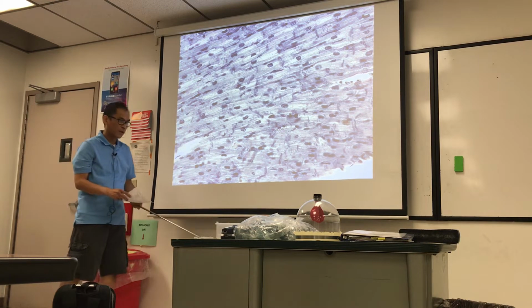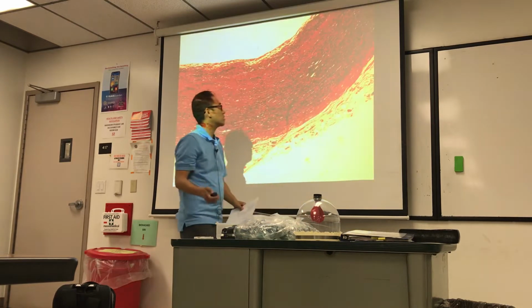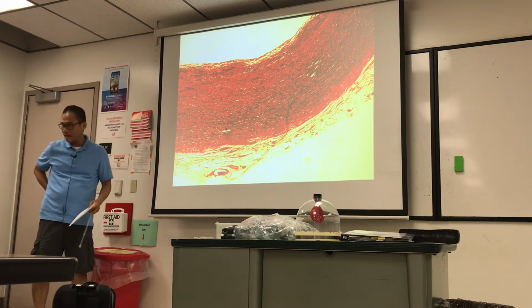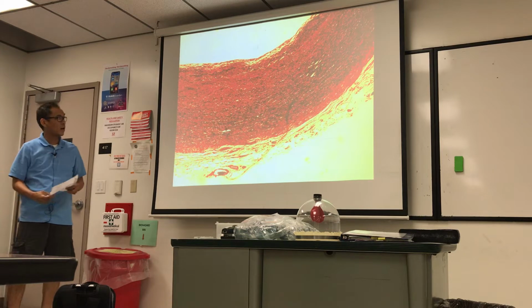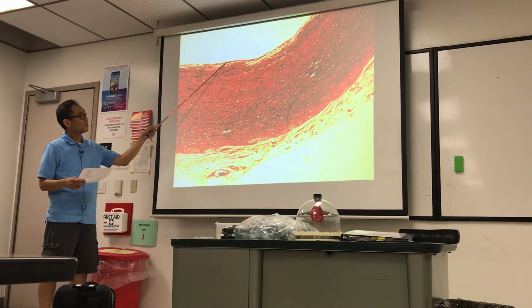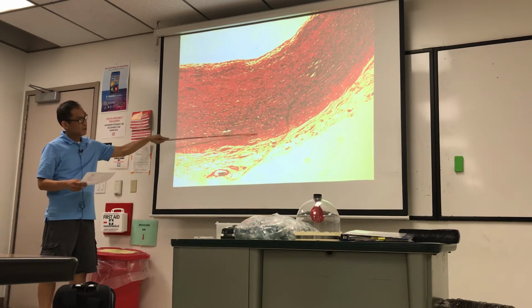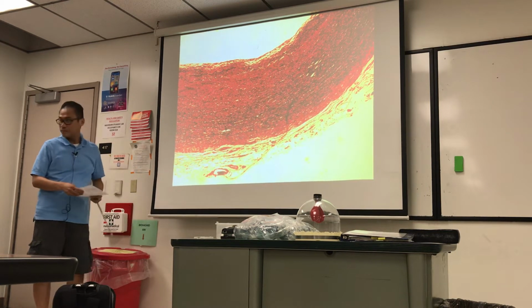So I started with the heart, then I have the arteries that it pumps blood into. The largest arteries close to the heart are elastic arteries. You may be asked to identify this blood vessel. It's an elastic artery. You can see all the black tissue are the elastic fibers. The high content is why we call this elastic artery. The tunics are, if I point to the top, tunica intima. Now, from here to here, tunica media, here to here, TA, tunica adventitia.